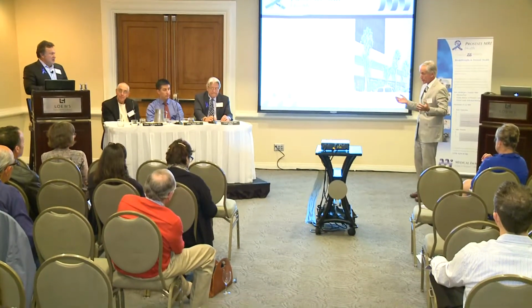And it's not me who will be reading all the prostates. I hope that in half a year you'll be reading your own prostates so that I don't have to. Well, it's nice to have a double reading. Double reading will be done. Quality control will be done. One out of 10 cases we will randomly choose. And perhaps we even should do double reading. That was the model for mammography, where two excellent mammographers reading the same image ends up with a better report. So we're already there, and although we've got Yeli at this level and us at this level, the final report is still, I think, a strong report.